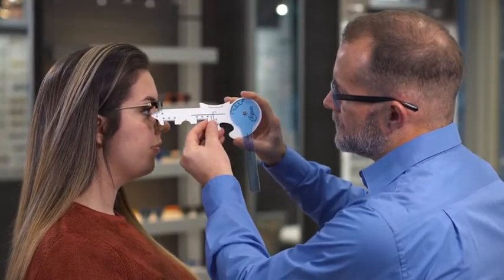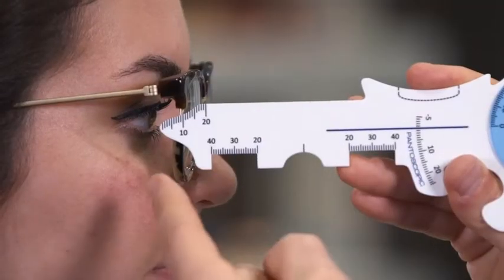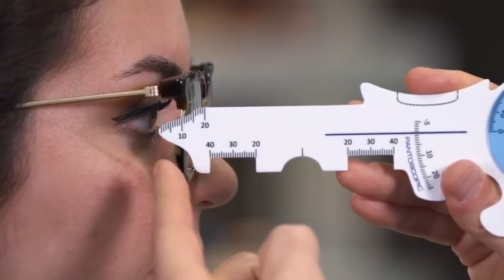Now we're on to Vertex Distance. You take the tool and measure where the pupil ends to the back of the frame, and there's your Vertex Distance. Once again, very easy to use.